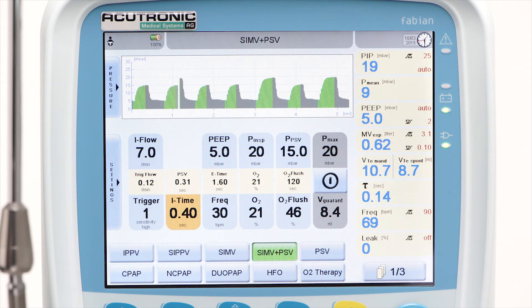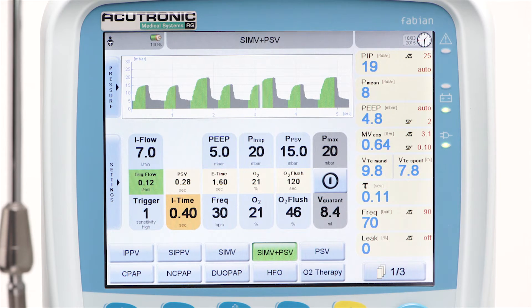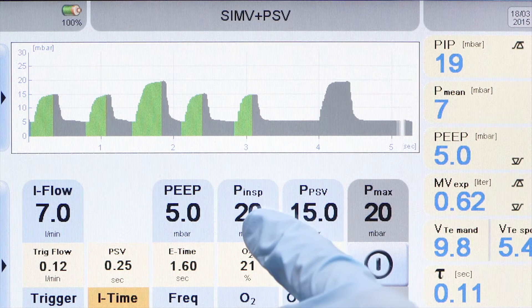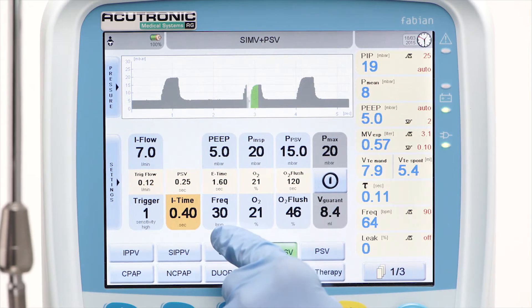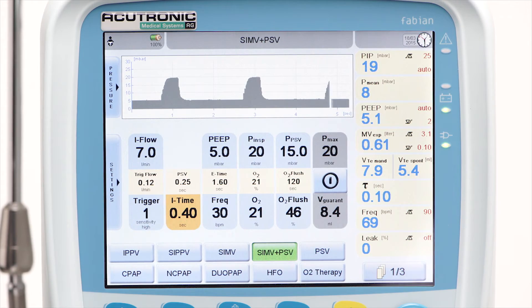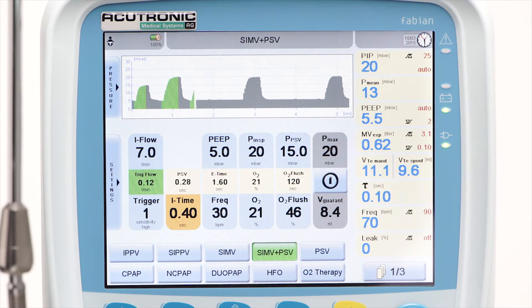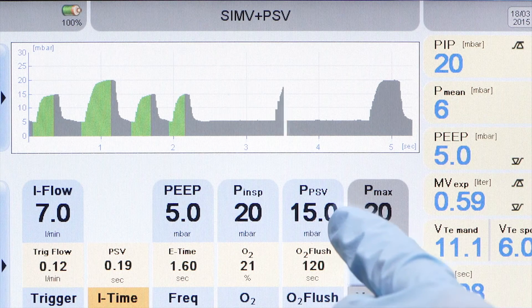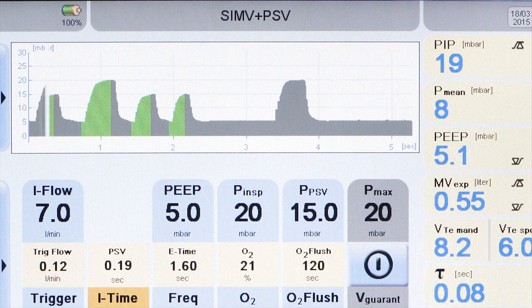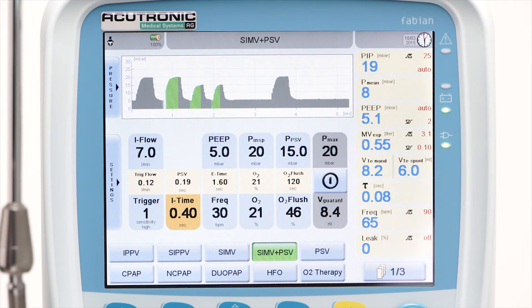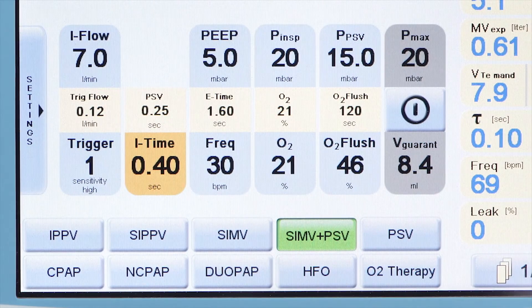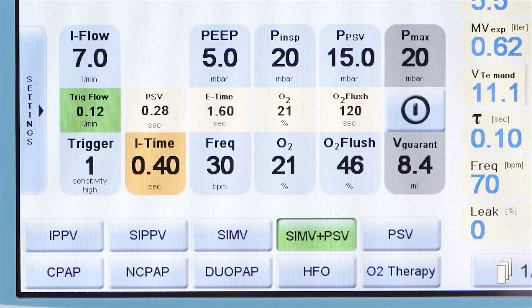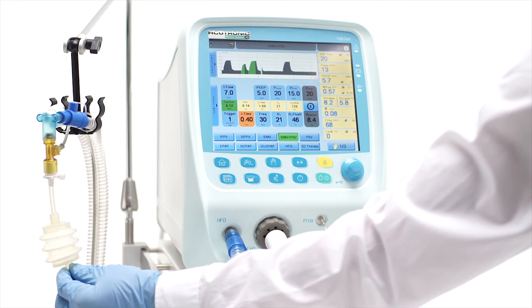In SIMV plus PSV there are two independent levels of pressure. Pinsp is the inspiratory pressure level for the SIMV breaths, which are time-cycled and delivered synchronized with a preset frequency. The pressure support level Ppsv is the pressure that assists each spontaneous breath in between the SIMV strokes. These pressure-assisted breaths are flow-cycled, so I-time is not fixed but fully controlled by the patient.